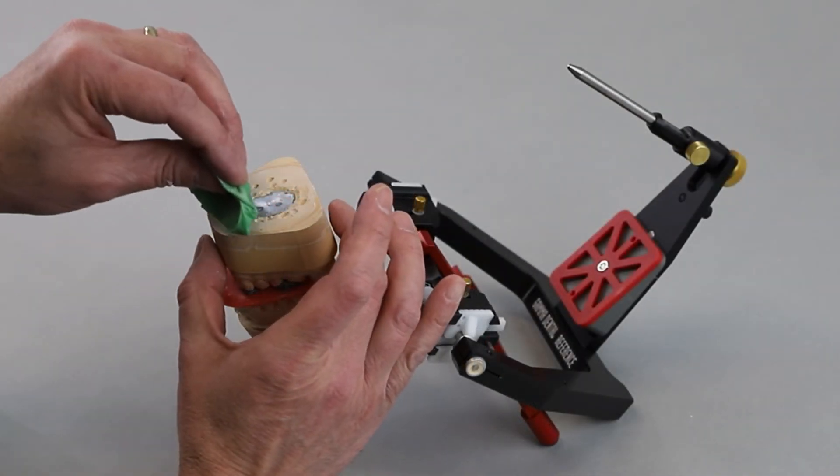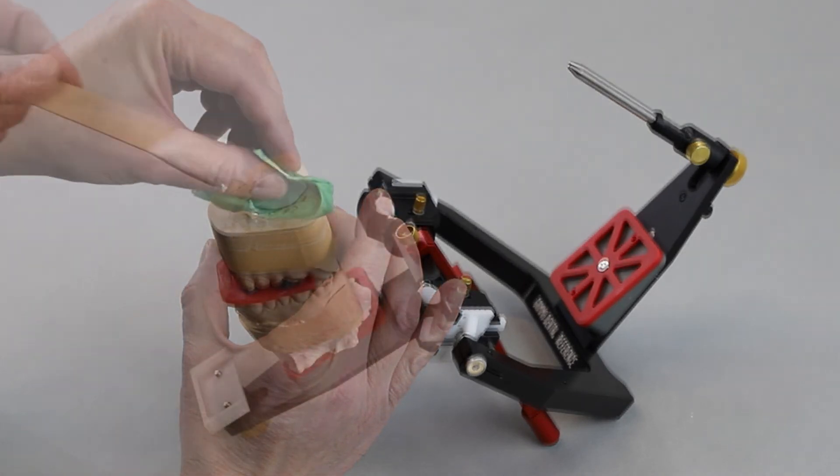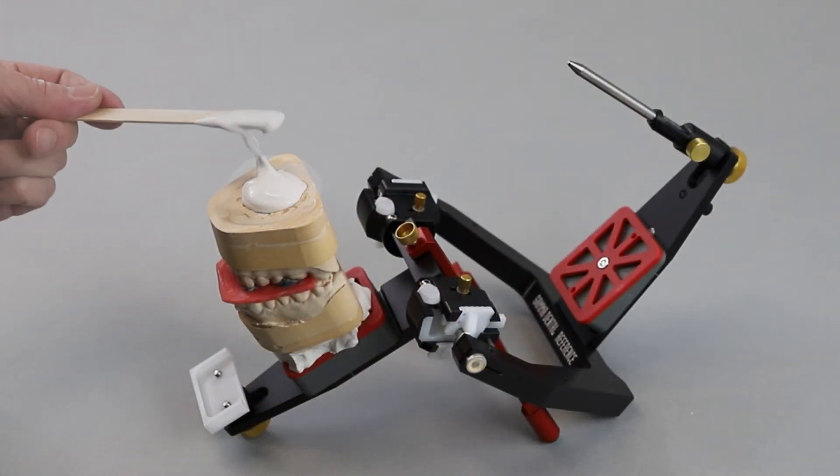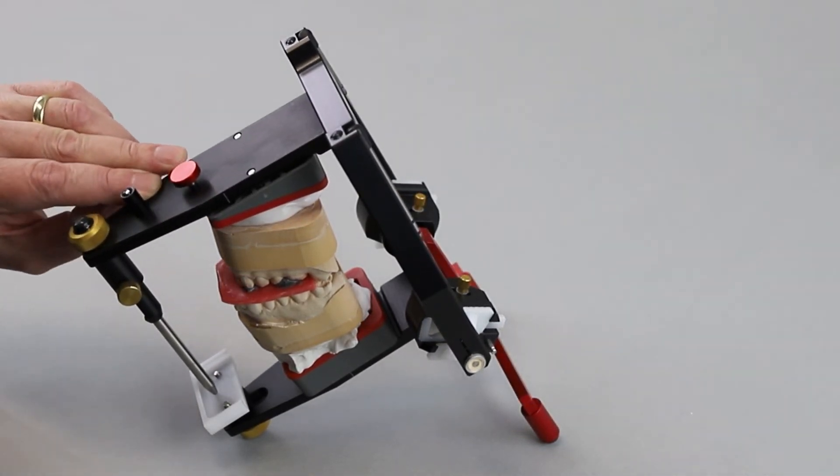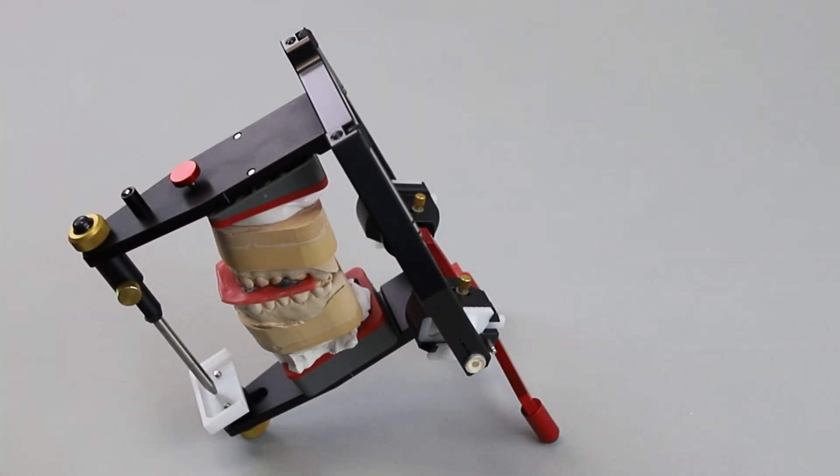Afterwards, the mandibular model is moistened and the mounting plaster is applied to the model and the mounting plate. Then the articulator is closed and the plaster hardens according to the manufacturer's instructions.